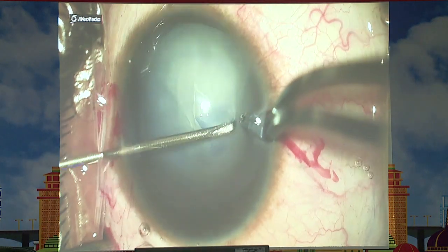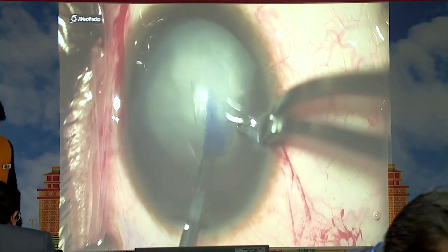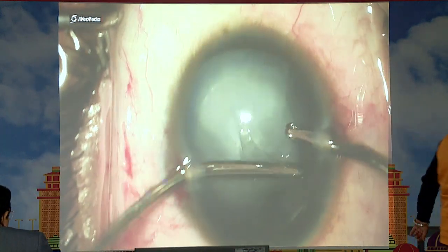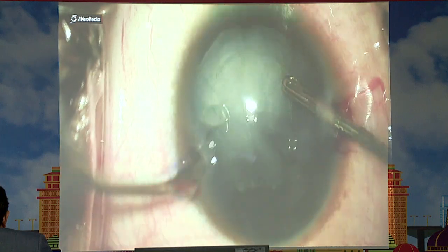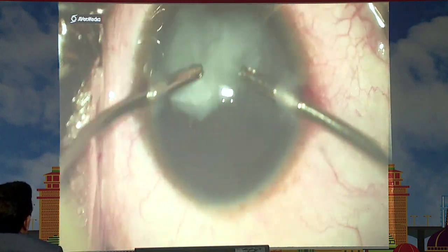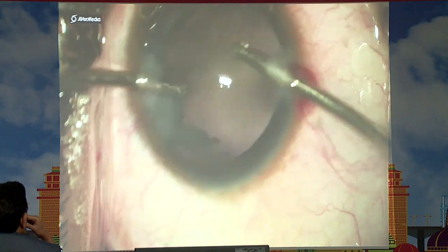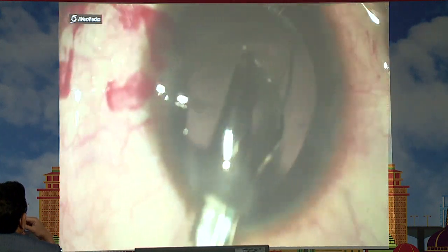Second scenario in pediatric patients is a blunt trauma leading to a PC defect, and you can see the line of the posterior capsular defect through the total cataract. So again, avoid hydro procedures. Why I have included this video is I'll show you the error that happens when you are not careful. Cortical aspiration went off very well without any vitreous loss, and here I come out suddenly, and what you see is vitreous popping up.